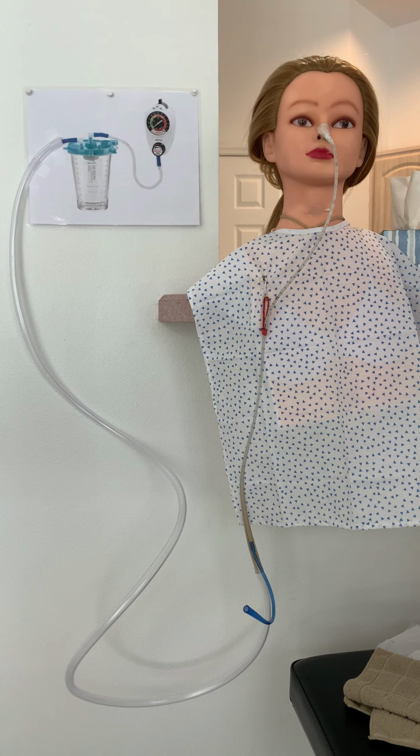So I'm going to go ahead and put your bed back down to a safe level. I'll make sure the side rails are up on both sides. We can go ahead and recline you to a comfortable level. You're usually better not to be supine with this, so I would just tip your head back a little bit. Just recline your bed a little bit.